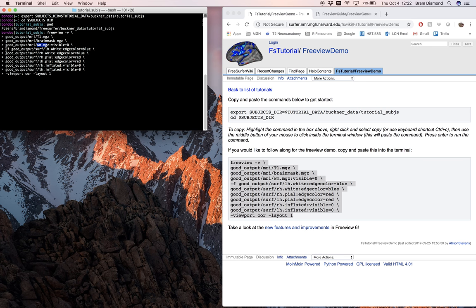After that we have the -f flag, which indicates that everything following it will be surface files. Here we have the left hemisphere white, the right hemisphere white, the right hemisphere pial, the left hemisphere pial, and the right and left hemisphere inflated surfaces.